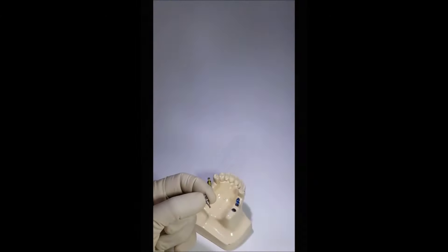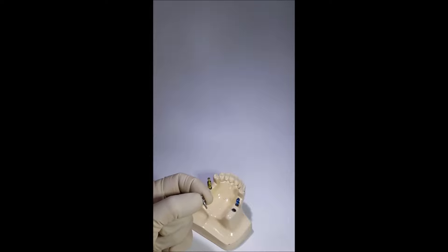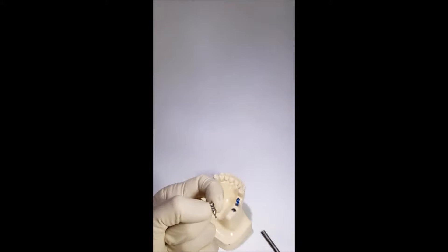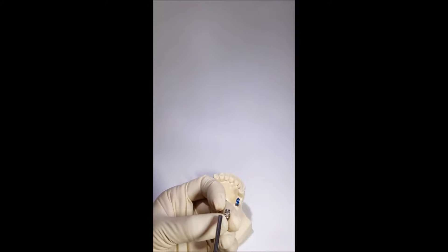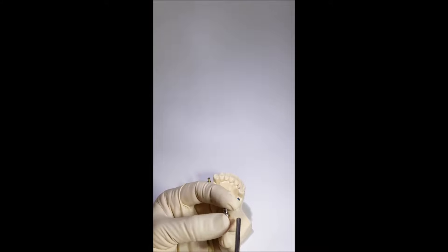The advantage of this technique is its suitability for clinical situations with implants placed too close to each other, as well as situations when the implant is placed in a distal zone where contracture — that is, limited mouth opening — prevents installing a longer transfer.